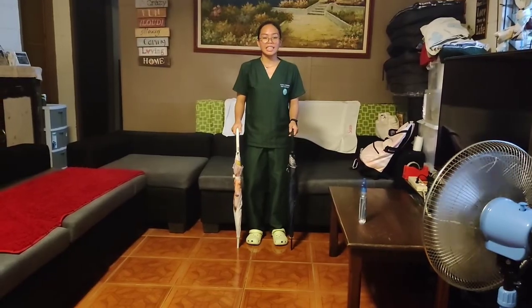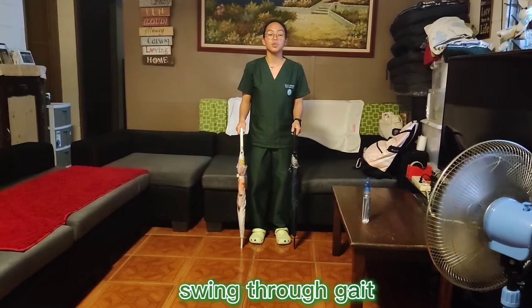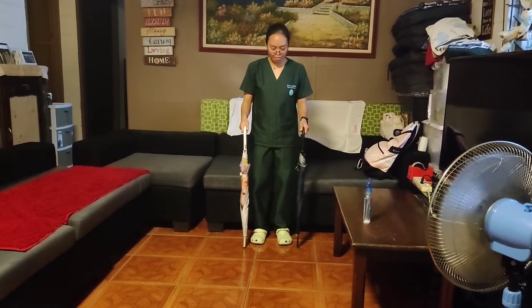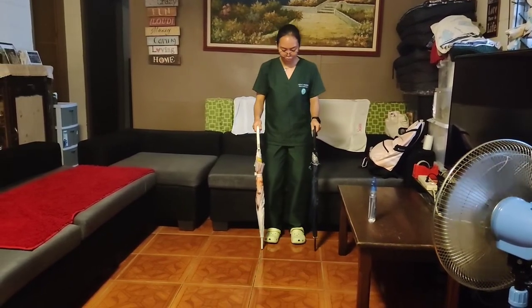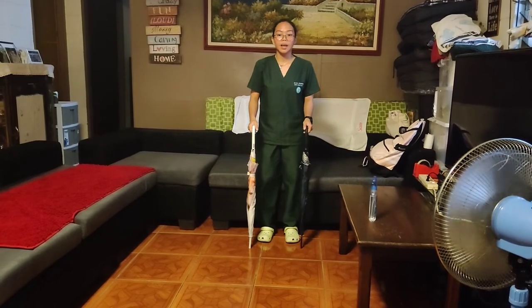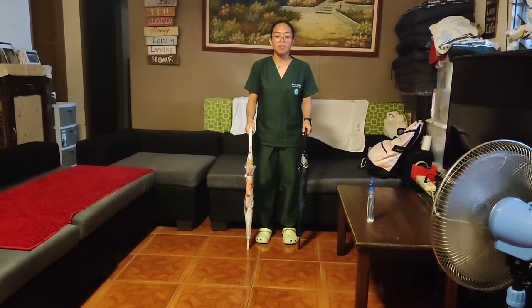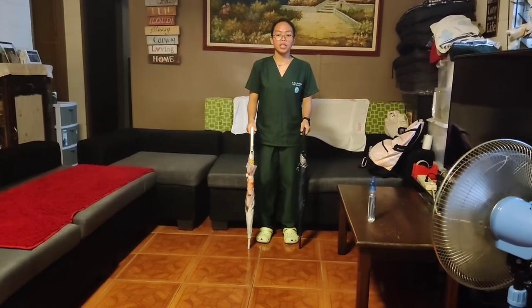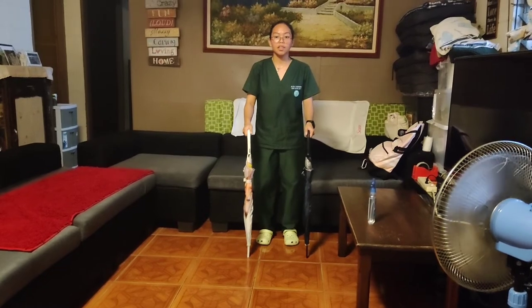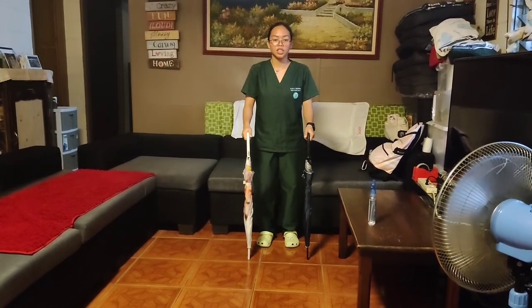Lastly for crutches, instruct the patient using the swing-through gait. Begin in the tripod position. Advance both crutches forward and lift, swinging both legs through and past the crutches.